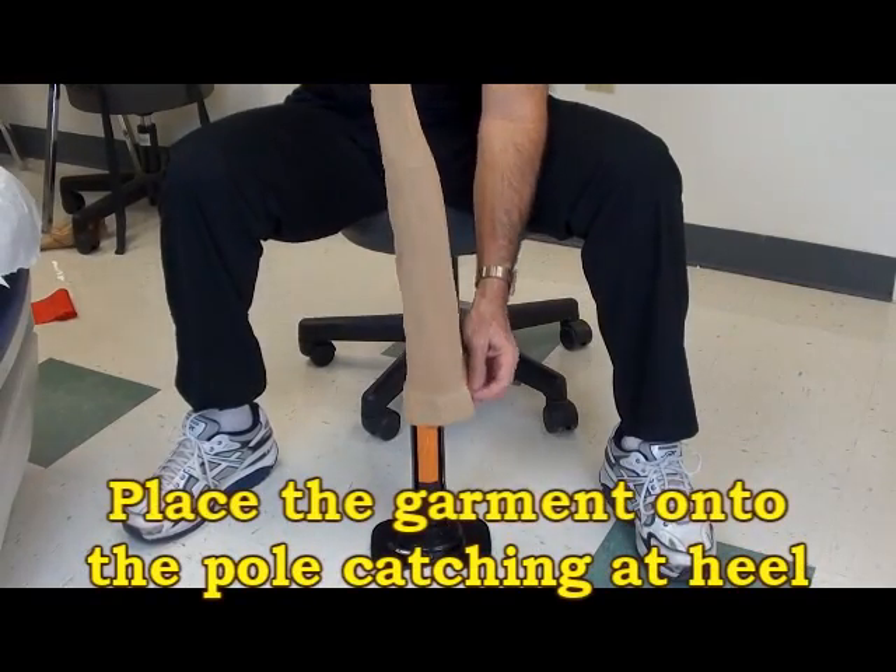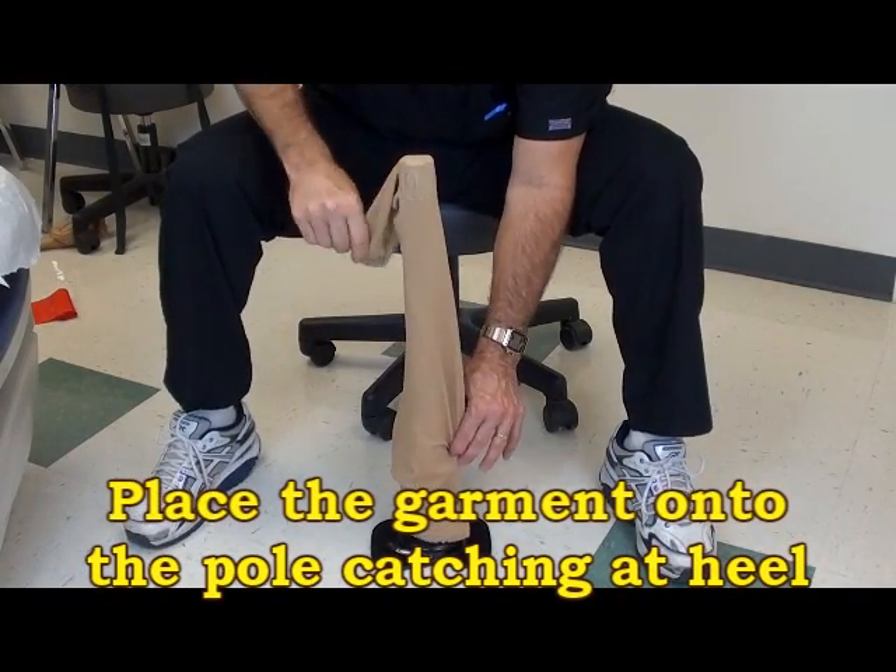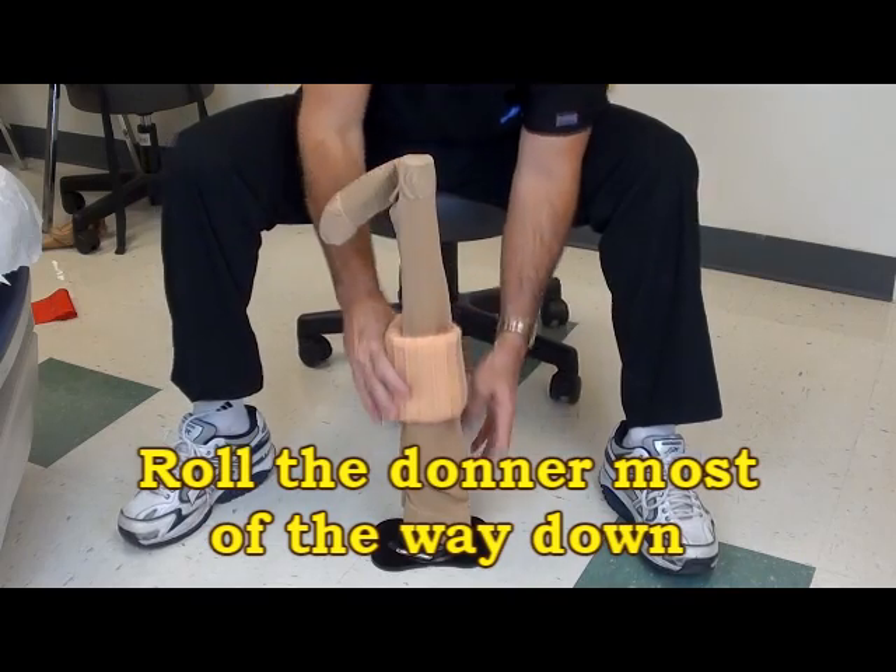These are instructions for using the donning pole for a half roll above the knee. Place the garment onto the pole, catching at the heel as shown, then roll the donner most of the way down.